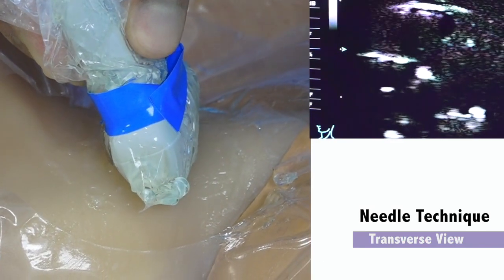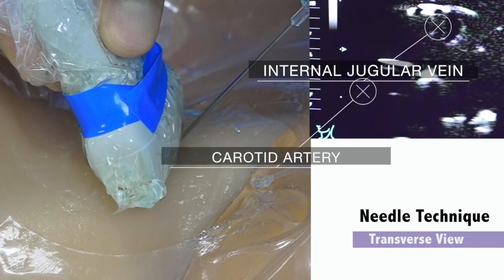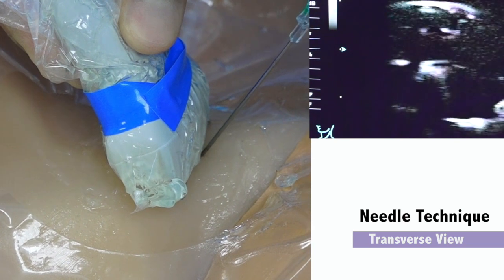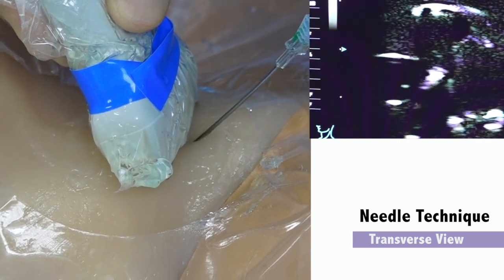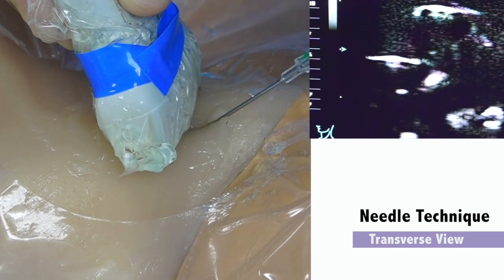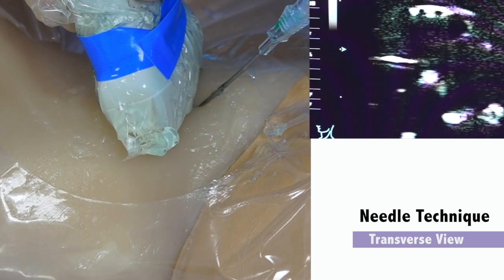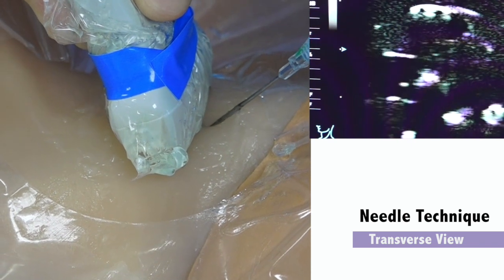When performing the basic needle technique, the ultrasound probe is aligned transversely to the vasculature. The internal jugular vein is identified as a compressible structure and the carotid artery as a pulsatile structure. The image is aligned with the internal jugular vein in the middle, ensuring correct orientation of the probe. The needle then punctures the skin at the midpoint of the ultrasound probe at a 45 degree angle, making sure not to puncture the sterile sheath.